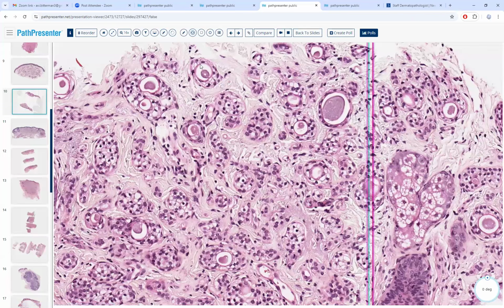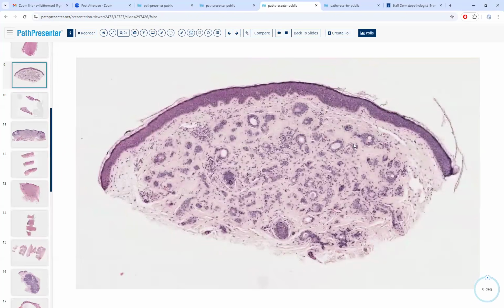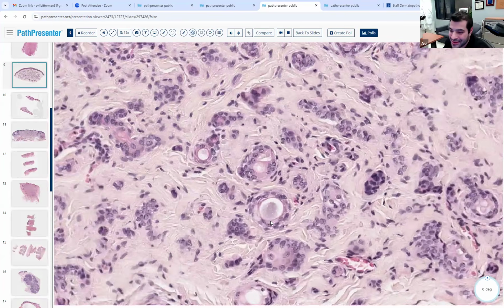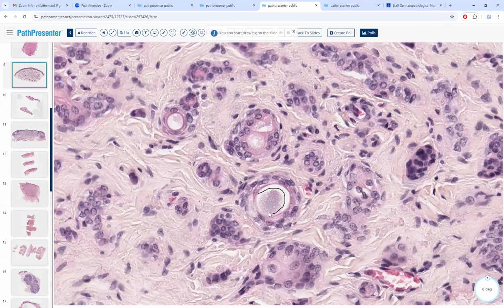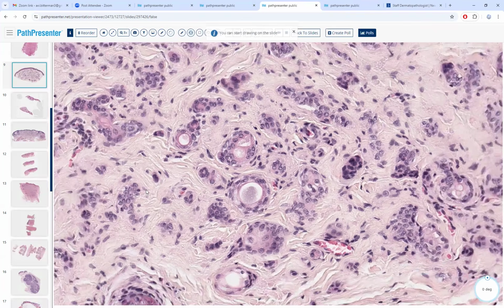How come we didn't see this, what you just said, Avi, in the prior specimen? Is it just the actual... Oh, I guess we do see it. Look, oh yeah, here, just a little bit. Okay. All right, yeah, you're right. See? Yeah. I didn't really see it on the lower power, but yeah.